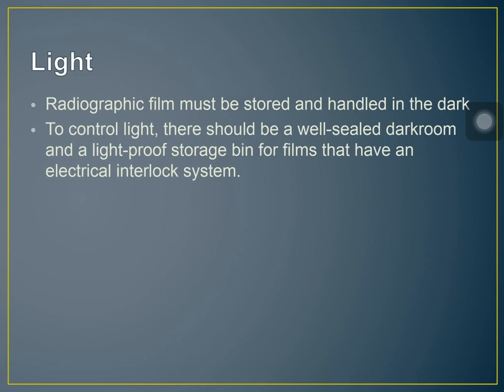If bright light exposes or partially exposes the film, a gross, obvious artifact is produced. Pag sinabi natin gross, obvious artifact is produced, kitang-kita na meron added density. Malaki yung added density on the radiograph. Matataklo ba ng unwanted density on the radiograph? Why? Na-expose yung film on a bright level. Kapag pasulyap lang, fog lang yung mapoproduce natin.